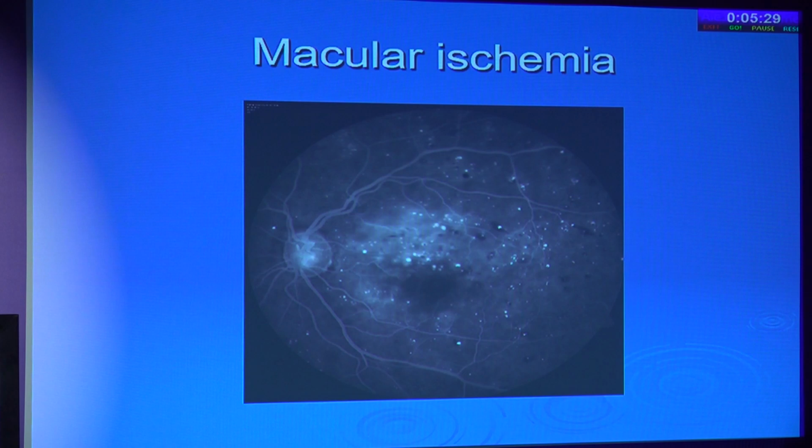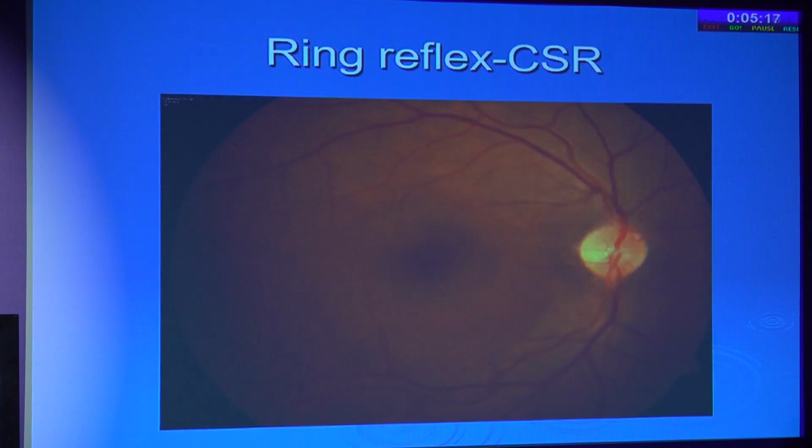So it can be recognized only, of course, now you have the OCTA that will help you. You don't have to do the invasive one, but in a severe NPDR, of course, a wide field angiography is better anyway, so that you don't miss out any peripheral NVE also.